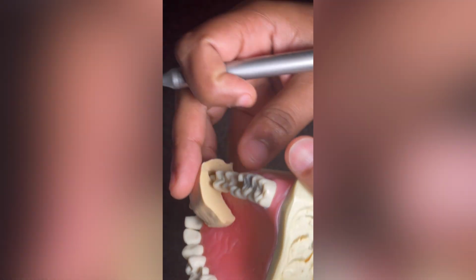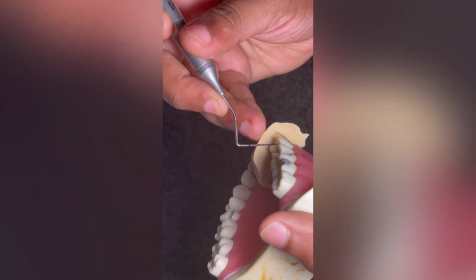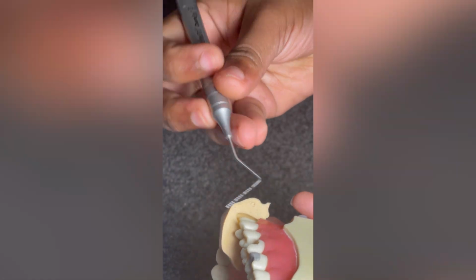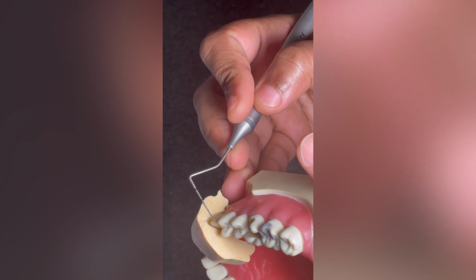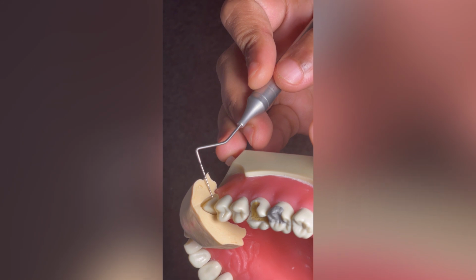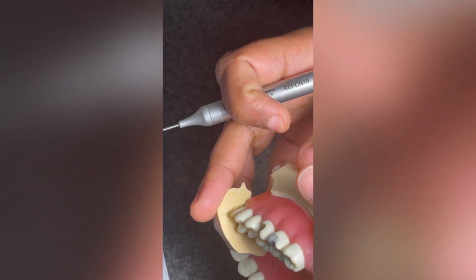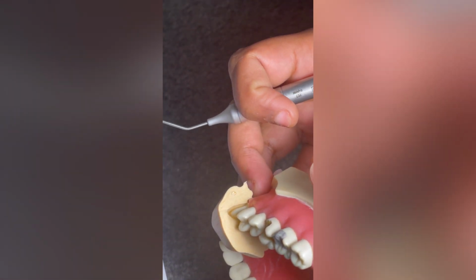The lingual reduction, usually I keep it less than 1. Let's have a look. Yeah, I would say 0.9 or maybe 1, if you can appreciate that. And then buccal reduction, buccal mesial distal reduction of 1.2. Let's have a look. It's actually a bit more, it's 1.8. And then here it's maybe 1.5. So with buccal mesial reduction of 1 to 1.8 you still fall under satisfactory, but I think I've reduced a bit more, so I will stay at 1.5, which is on the safe side.